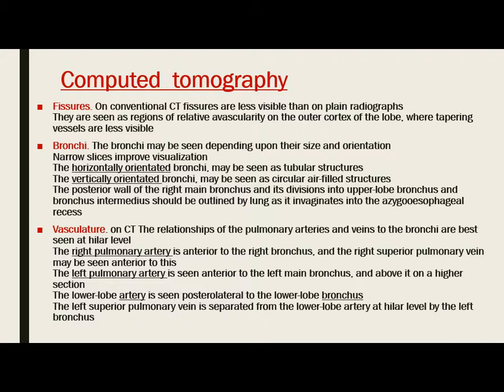On computed tomography, the fissures are less visible than on plain radiographs. They are seen as regions of relative avascularity on the outer cortex of the lobe, where tapering vessels are less visible. The bronchi may be seen depending upon their size and orientation. Narrow slices improve visualization of the bronchi. Horizontally-oriented bronchi, such as the anterior segments of the upper lobes and superior segments of the lower lobes, may be seen as a tubular structure, while vertically-orientated bronchi such as the main bronchi and bronchus intermedius may be seen as a circular air-filled structure. The posterior wall of the right main bronchus and its division into upper lobe and bronchus intermedius should be outlined by lung as it invaginates into the azygoesophageal recess.